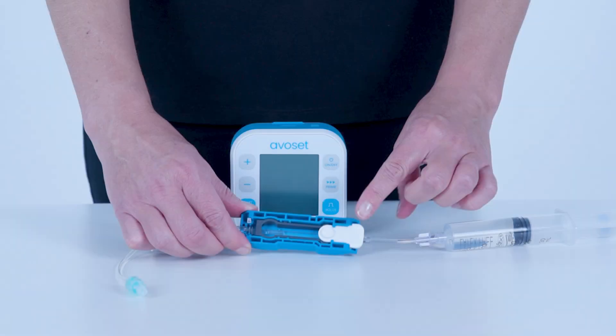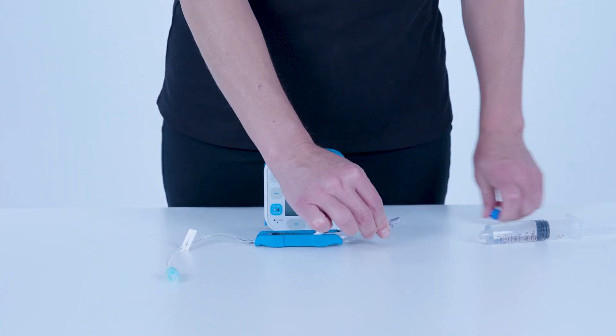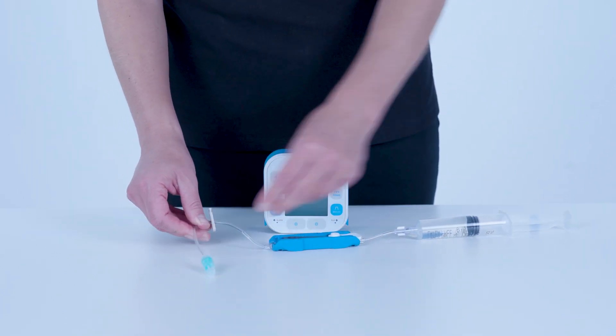The Administration Set has an anti-free flow valve. When the white release clip is in place, it keeps the valve open and allows for manual prime. When the white release clip is removed, it protects against accidental fluid flow. Begin by checking that the Administration Set is connected to the fluid reservoir of choice, clamps are closed, and the white clip is in place.